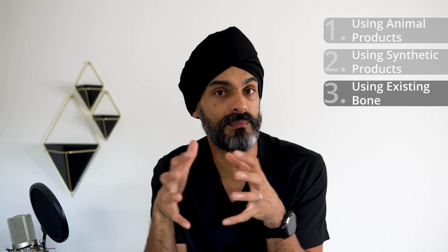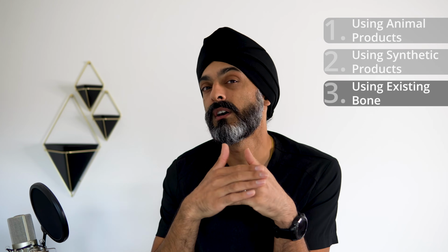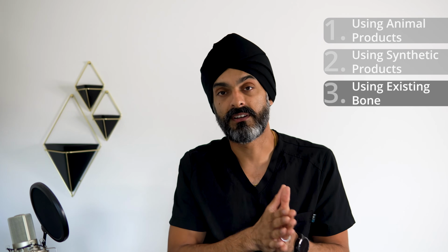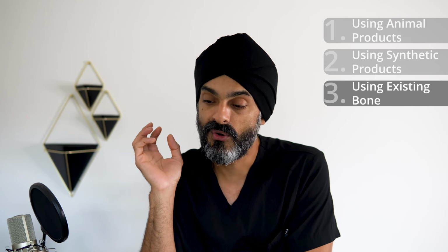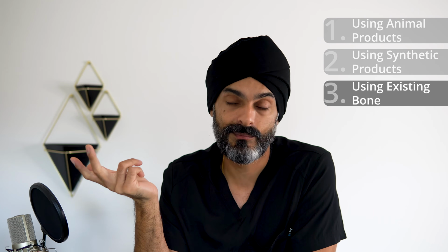Now, one thing to realize with any bone grafting is that most of the time, there's going to be some level of shrinkage. Okay, so when we do the bone graft, it looks fantastic, but over time, 3, 4, 5, 6 months, the bone is going to shrink a little bit. So typically, if we're doing the bone graft and the implant on separate occasions, we'll do the bone graft, let it shrink a little bit, and then put our implant in, and then we will do a mini bone graft at that time. And quite often we'll use the animal product bone at that time, again, because it's quick, easy, and simple. And most people are okay with it.